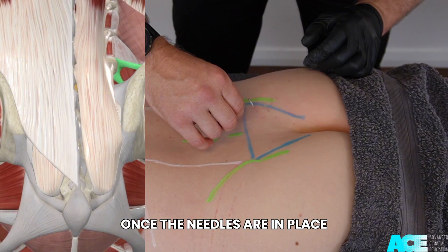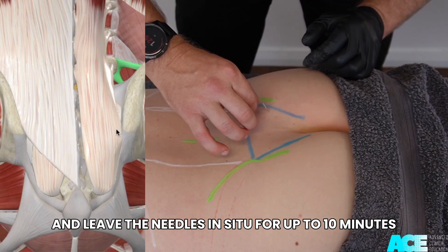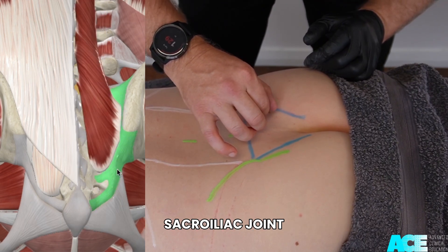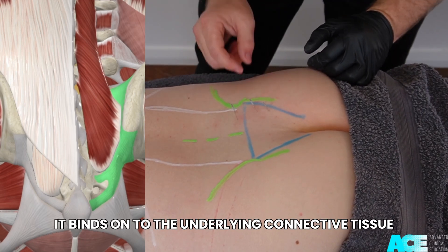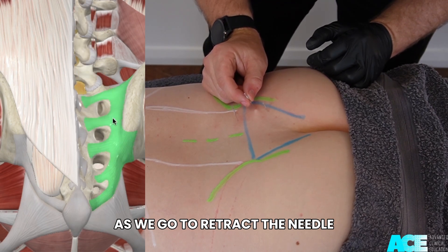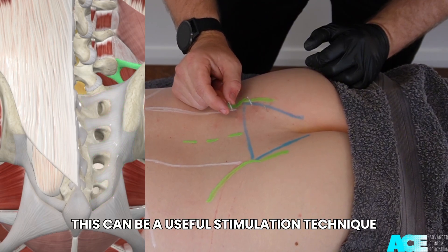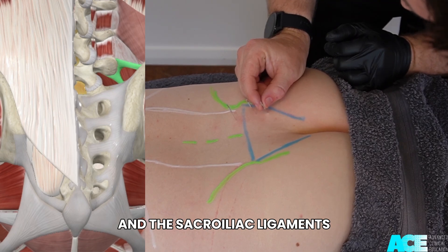Once the needles are in place, we can perform a unidirectional winding technique and leave the needles in situ for up to 10 minutes. This is a useful technique for a sensitized sacroiliac joint. Here we can see that by winding the needle, it binds onto the underlying connective tissue. As we go to retract the needle, the tissue has grabbed onto the shaft of the needle. This can be a useful stimulation technique to stimulate the iliolumbar ligament and the sacroiliac ligaments.